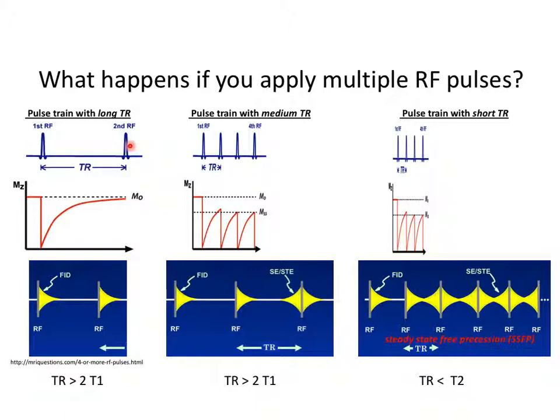The issue with doing that is that if the slices become too close together, the RF pulses from one slice start interfering with the contrast in the next slice. You start getting crosstalk between slices, and the contrast mechanisms aren't simple anymore. It generates artifacts. And so you usually need some gap between the slices to keep everything simple.